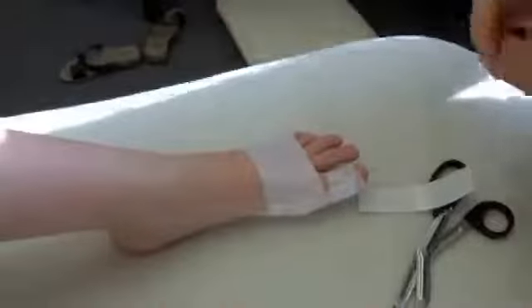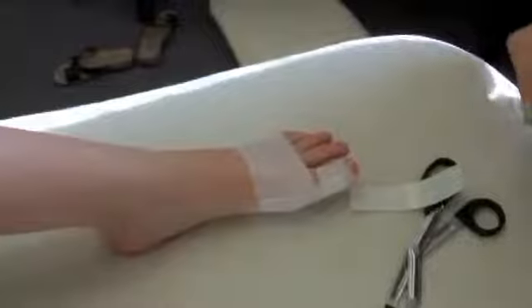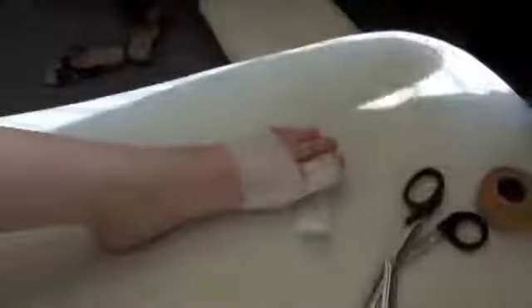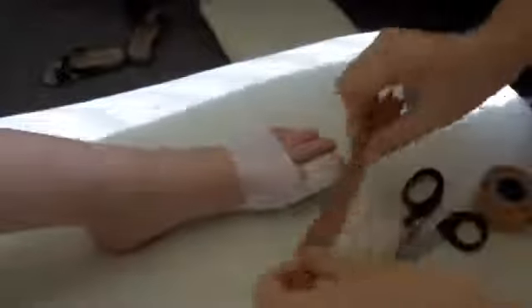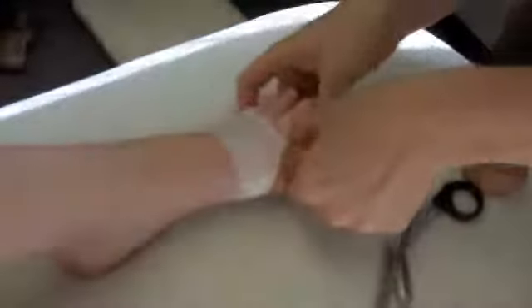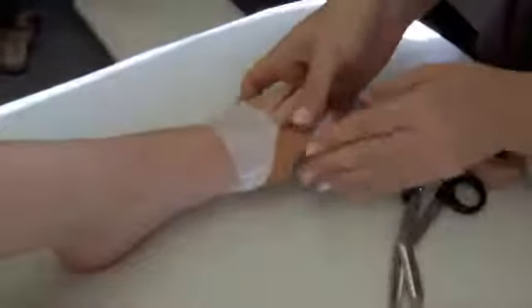So already it's looking nice and straight, a little bit straighter. Then with the rigid tape, start underneath the big toe. Now I want to just gently rotate it out, pull this up around — so that's the strong bit — and then just gently stick it to the outside.